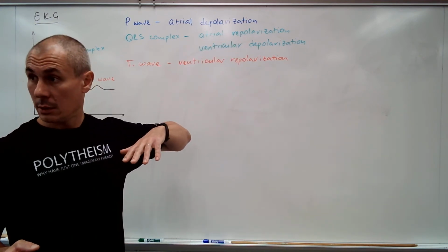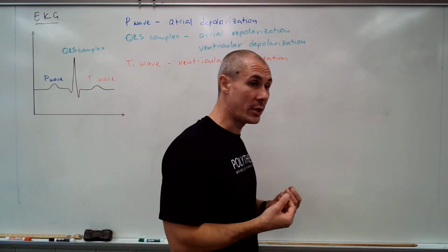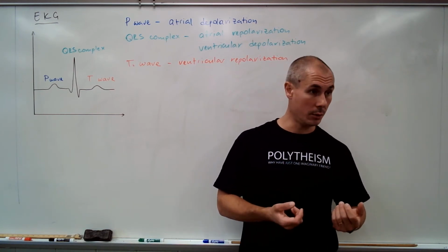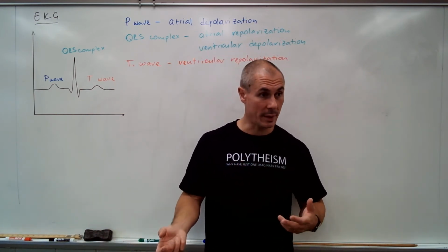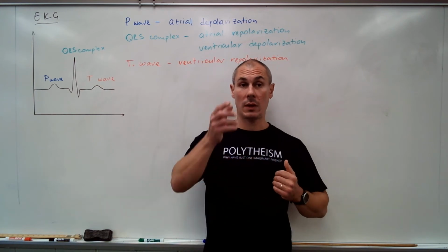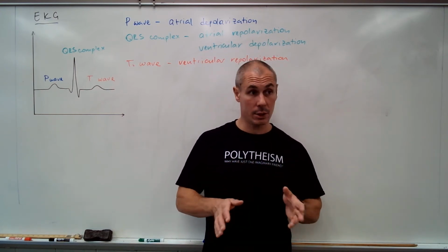By looking at the EKG of a patient, we can measure how much time it takes for the impulse to go from the SA node to the Purkinje fibers. There is a certain range it should be in. If it takes longer than that, there is something wrong with the conduction system. Maybe the AV node is dysfunctional, maybe the bundles are dysfunctional, it all can be.